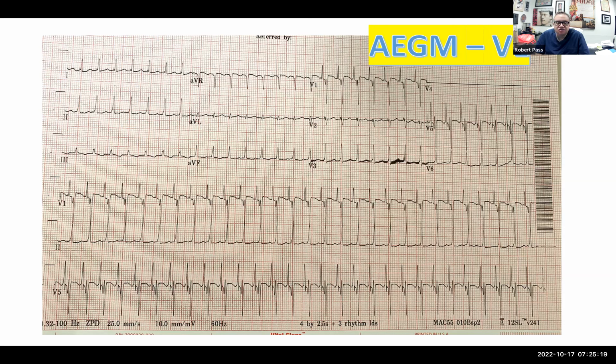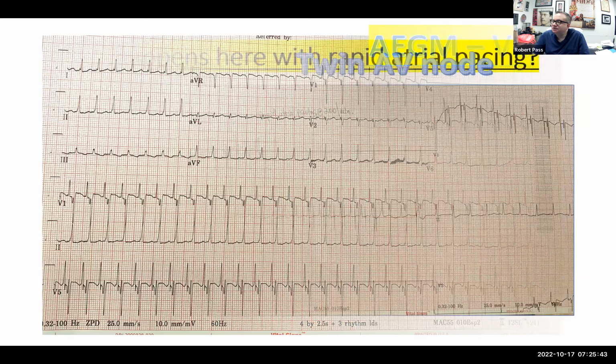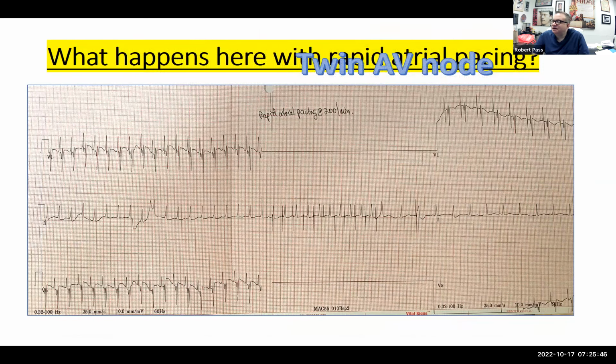All right. So this rhythm actually came on suddenly. I'll give you that extra datum. So anything else? Is there variability, or is it responsive to adenosine if you did that? Well, good question. It is not varying. And the doctors in the ICU were kind enough to rapidly pace the patient at 200 beats per minute, and then the rhythm changed to this rhythm.